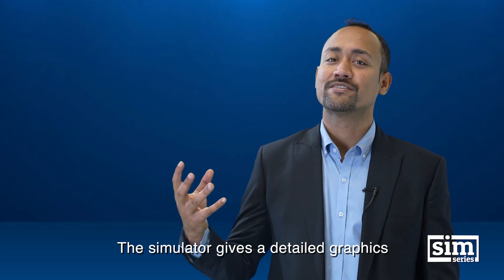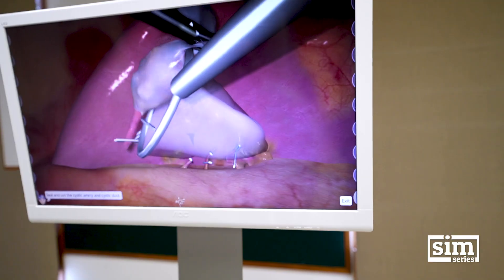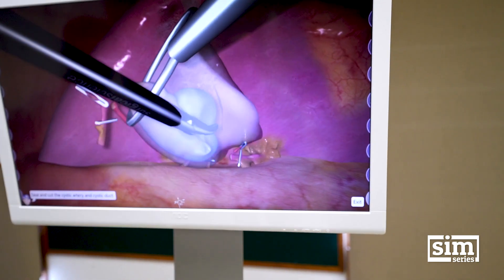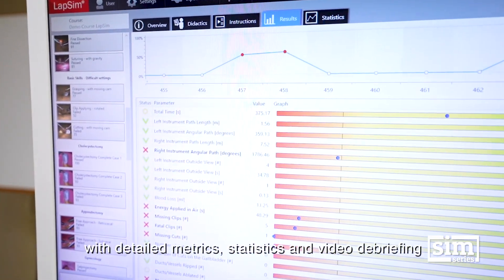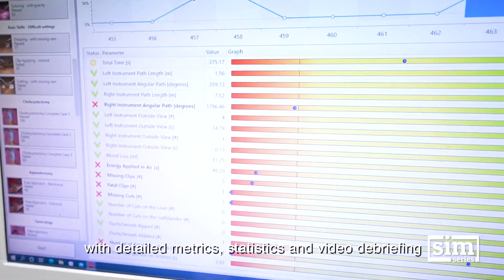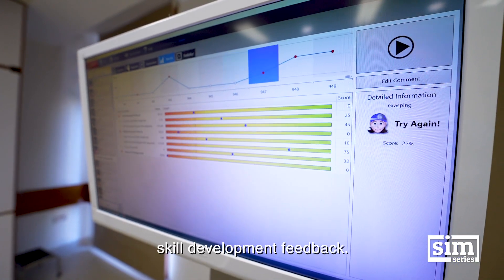The simulator delivers detailed graphics with haptic feedback. Each exercise is digitally recorded with detailed metrics, statistics, and video debriefing, providing both immediate and long-term skill development feedback.